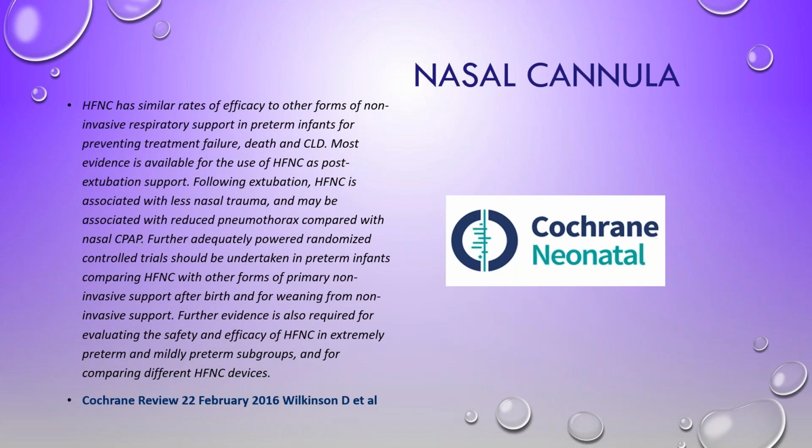Following extubation, high flow nasal cannula is associated with less nasal trauma and may be associated with reduced pneumothorax compared to nasal CPAP.